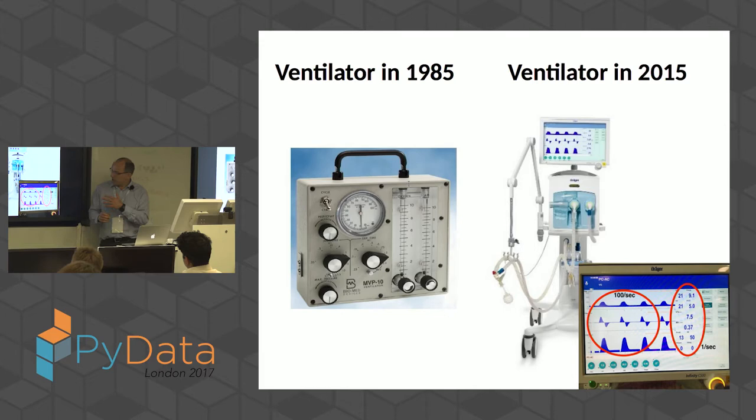Today, ventilators still have their mechanical parts, but they are primarily computers. And because they are powerful computers, they are creating beneficial and harmful interactions with the patient's own breathing effort. The other thing I would like to mention is that we very rarely sedate and muscle relax babies to a point that they don't breathe at all. This is not what modern neonatal medicine does.